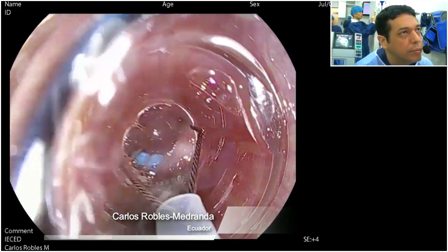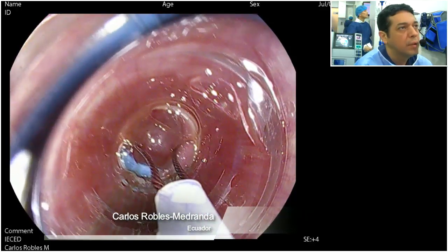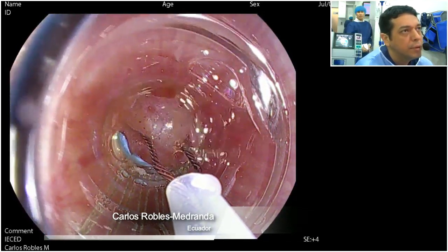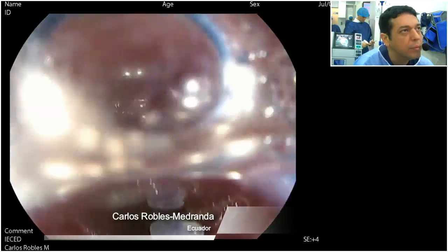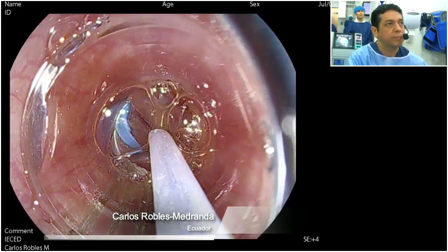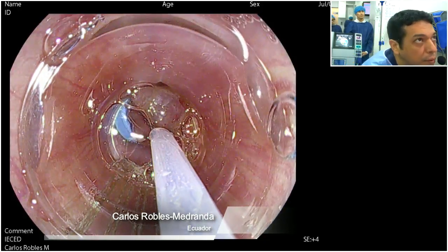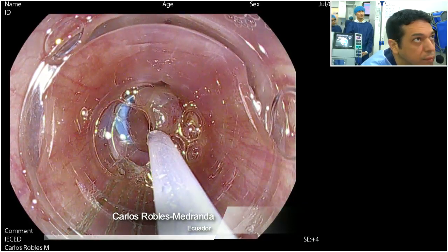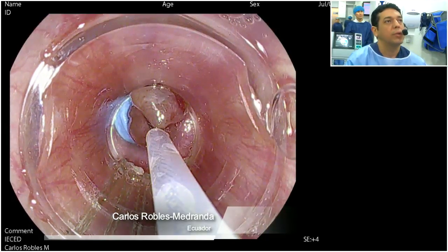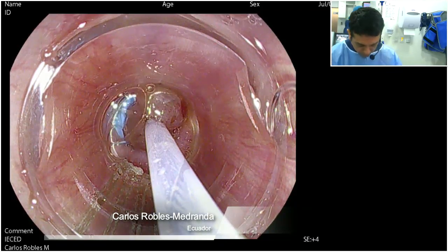Close a little bit, please. Close. Close. Okay, moment. Open, slowly. Okay. So now I have my lesion. My lesion is okay. Close. The lesion is up. That's why I use digital. Do you have everything? Okay. Ready. Now I will cut.